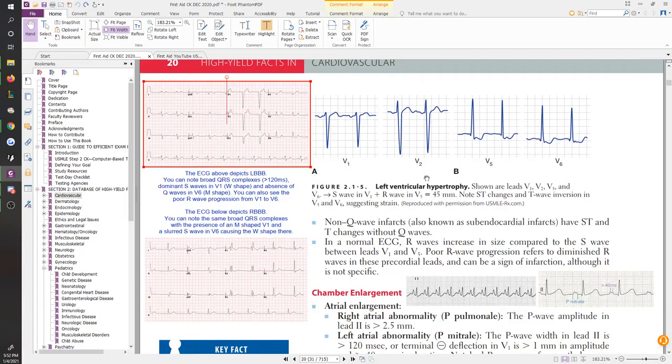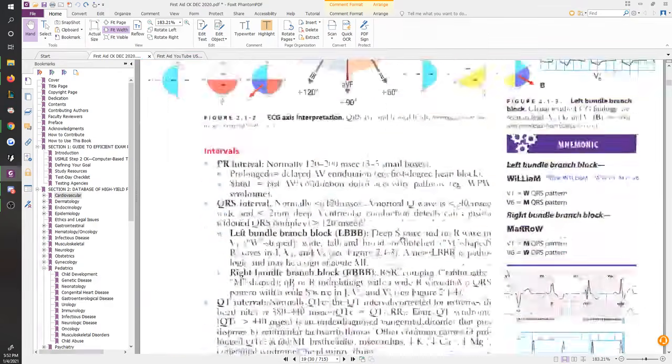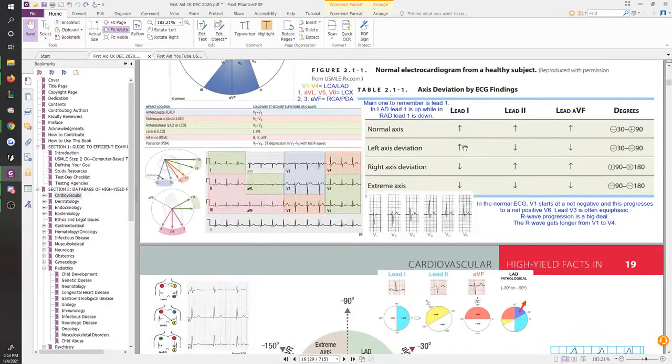This is supposed to be showing you left ventricular hypertrophy. So again, you're thinking the left heart is very, very strong now, much stronger than the right heart. So immediately from the topics we've already covered, you would assume that the person with left ventricular hypertrophy would have left axis deviation. And we already talked about it, that left axis deviation is one of the things where lead 1 stays pointing up and the other two leads are going to be pointing down, right? Lead 1 is supposed to stay pointing up. That's normal. But lead 2 and aVF should also be pointing up, and they won't.